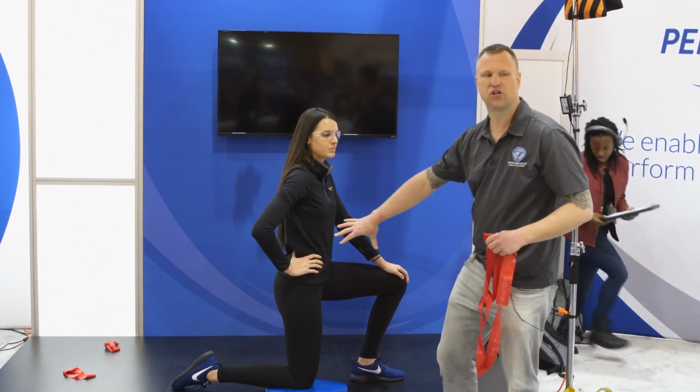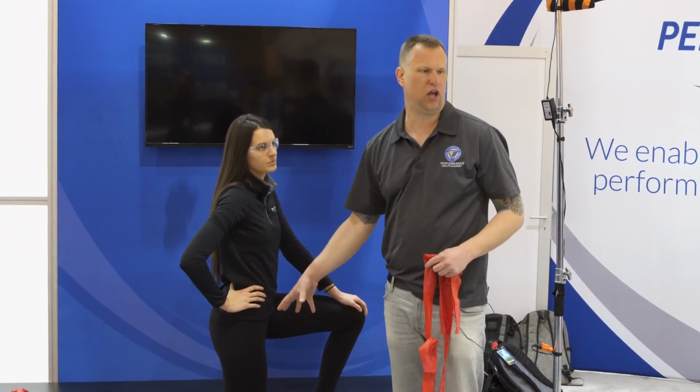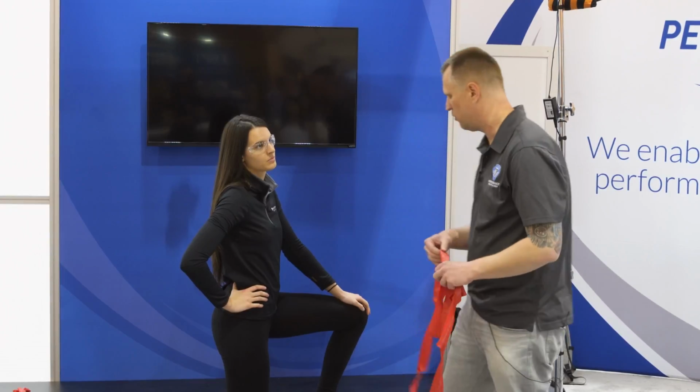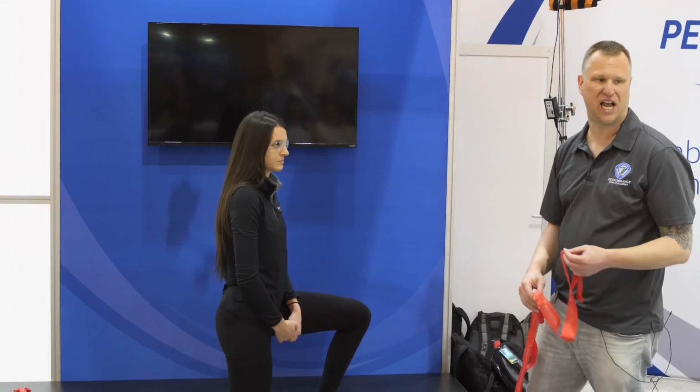This, as far as functional activities on her hip, hasn't changed anything from when she's standing. We've just reduced load, or reduced torque, I should say, by removing that lever arm. So she's already, to some degree, stabilizing. The lack of challenge for her is that she's fit, okay? Some of our patients, this right here is a challenge for them.